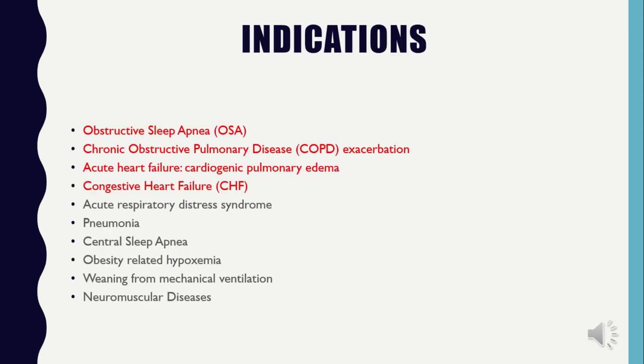So indications for the use of BiPAP would include obstructive sleep apnea, chronic obstructive pulmonary disease, COPD exacerbation, acute heart failure, cardiogenic pulmonary edema, and congestive heart failure.